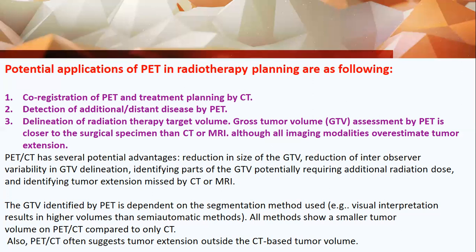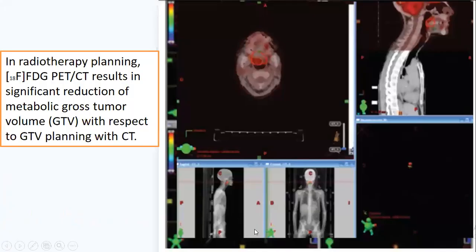All methods show a smaller tumor volume on PET-CT compared to CT scan alone, although PET-CT often suggests tumor extension outside the CT-based tumor volume. This example for radiotherapy planning using FDG shows a significant reduction in the size of the GTV compared to CT scan findings.